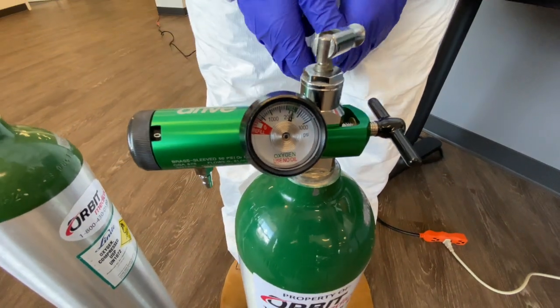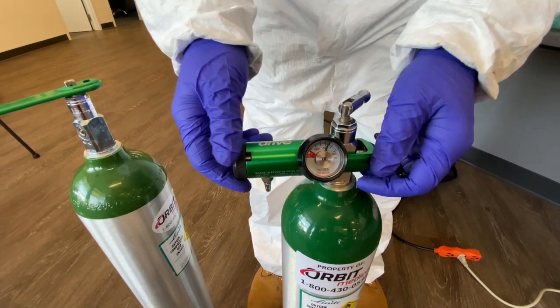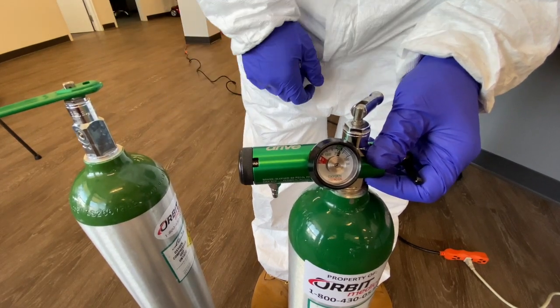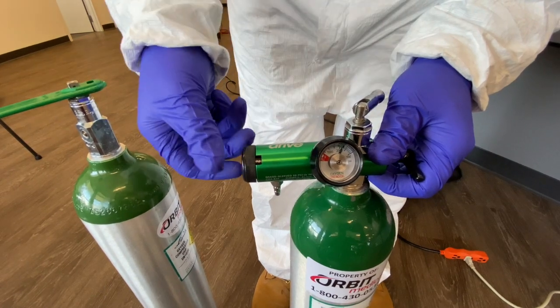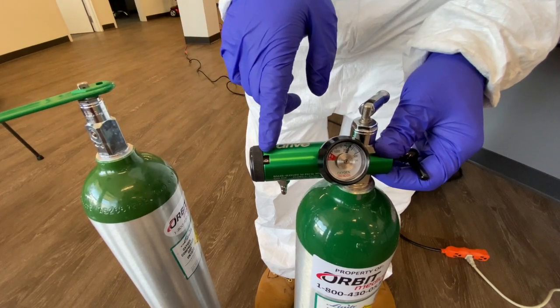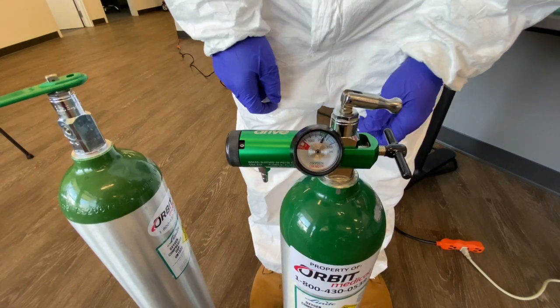Now that I've got the e-tank turned on, I can go ahead and rotate this to two liters per minute for this demonstration. When you're not using the tank, make sure you rotate this back to zero and then rotate it clockwise to turn off the tank.